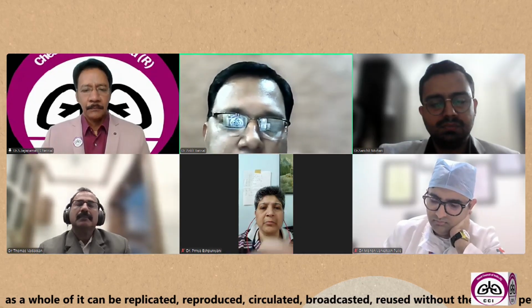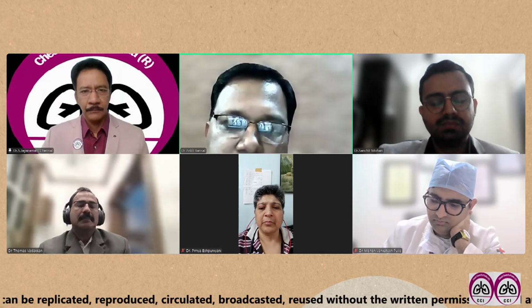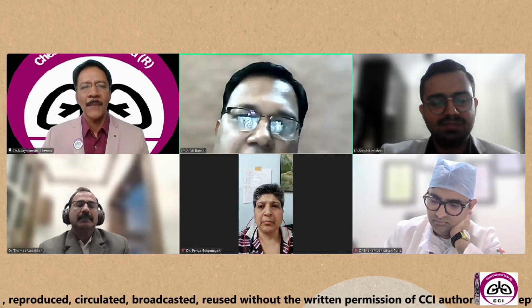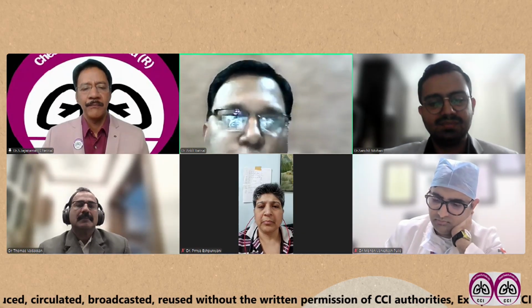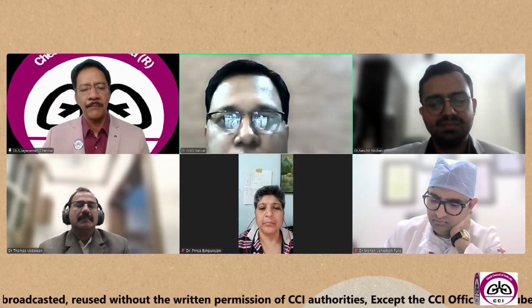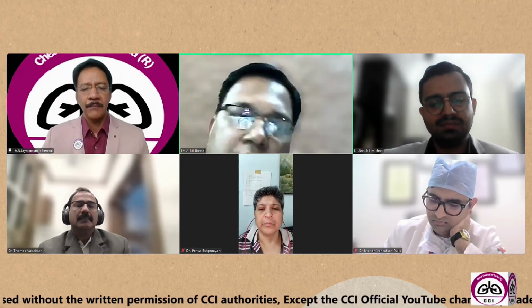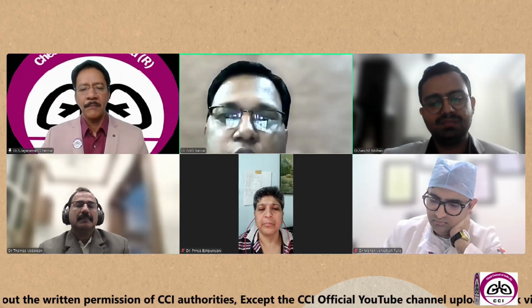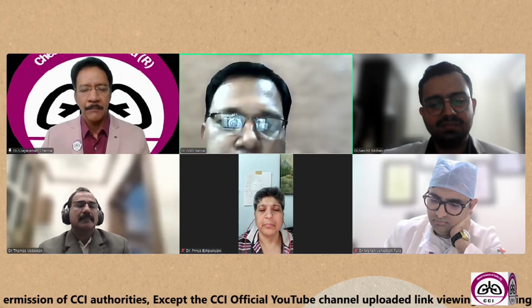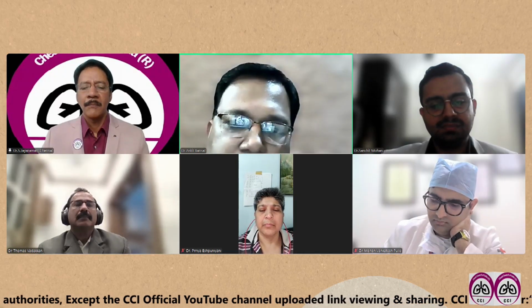That is important. So, as rightly said by my dear friend Dr. Sanchit, vessels are the compass and your lymph nodes are your destination. So you should never navigate without your compass. While you are moving sagittally, it is important to demarcate your landmarks of vessels. You should identify the vessels, be it the pulmonary artery, aorta, SVC, or azygous vein.